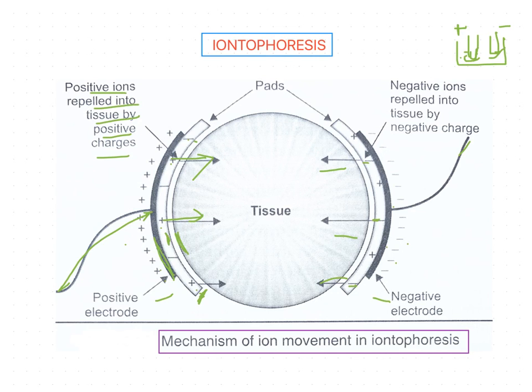The positively charged ions produced are made to drift away from the positively charged pole towards the negative pole. So positive ions go to the negative pole and negative ions go to the positive pole.